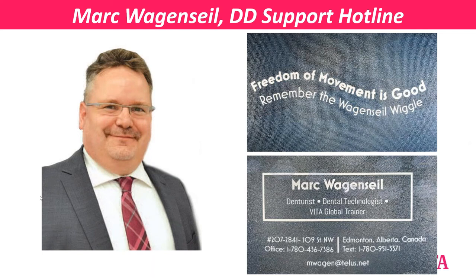What parameters have changed from the existing denture to today's try-in that you're trying in? If there's a vast change of vertical, if there's a vast change in, say, thickness, if there's a vast change in size, because the old one was underextended and now the new one's more extended, you are changing the perception of the central nervous system when you try in that denture. So the chances of the central nervous system giving an incorrect reading that the bite is correct, then I would say yes, I would be more in tune to take a check bite on that case.